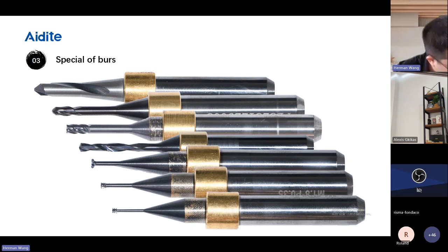打印机打印和切削的适配。目前我们的切削机还没有和打印机做这种打印和切削的适配，因为这个需要和固定的打印机型号做匹配。Okay, so currently there's no compatibility between milling machine and metal printing yet.